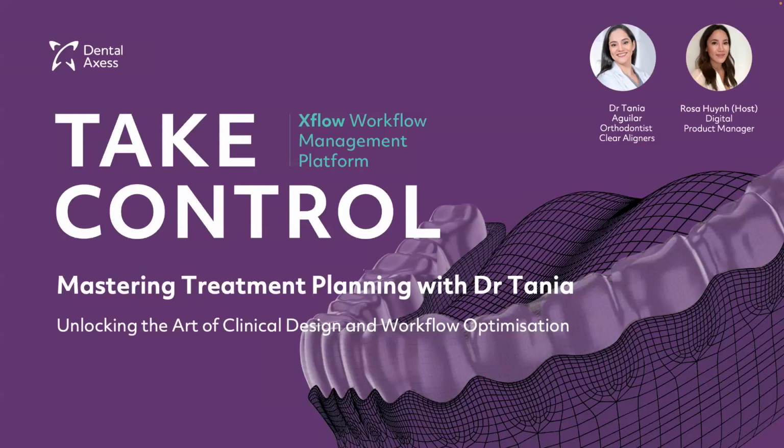Throughout this webinar, Dr. Tania will share invaluable insights, practical strategies, and demonstrate how you can take control of your treatment planning processes. I will then jump in and talk about the role of artificial intelligence in retainer designs, and showcase how technologies such as a workflow management platform like Xflow, coupled with CAD software such as Vision, can help streamline your treatment planning workflow.